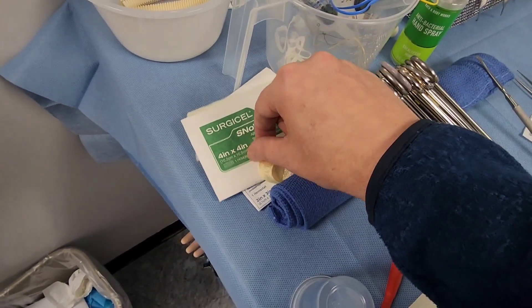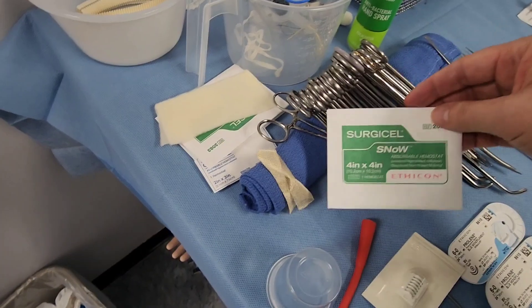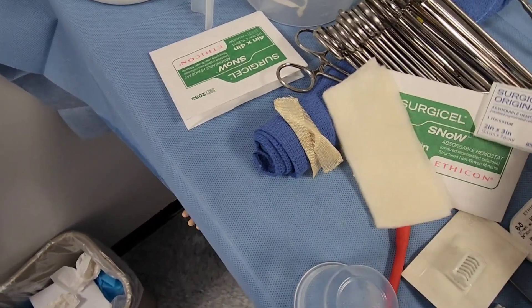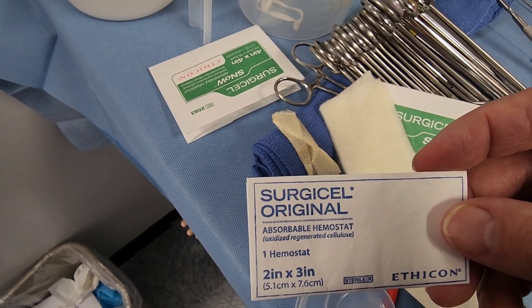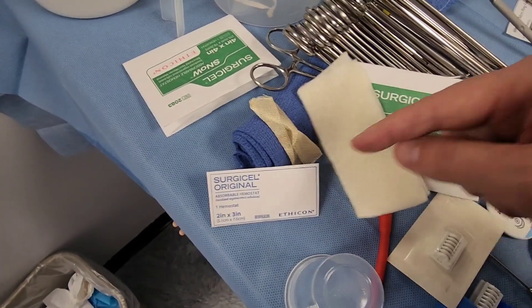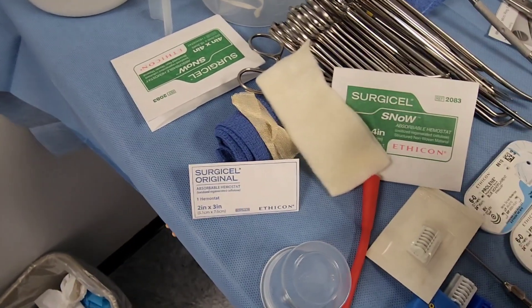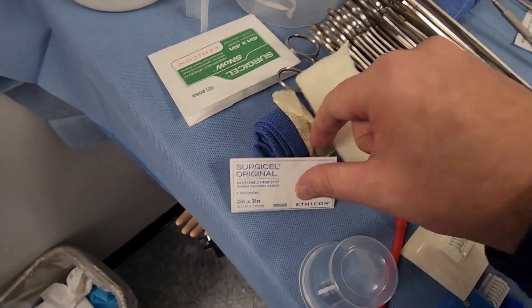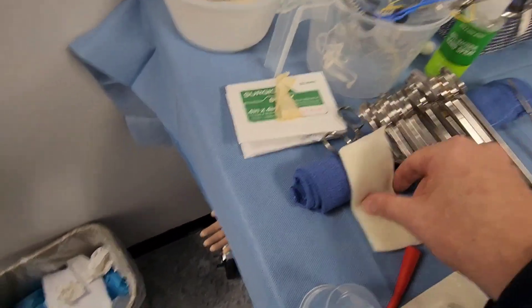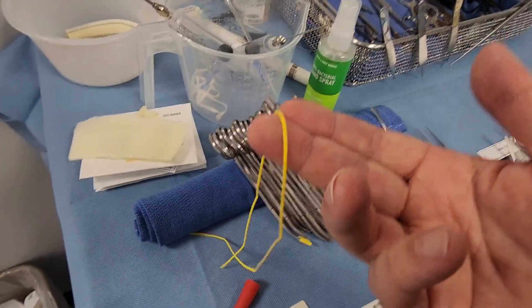Here we have hemostatic agents: Surgicel and Snow. These are absorbable hemostatic agents made of oxidized cellulose. The biggest difference between Snow and Surgicel is that Snow is a little more fine and can get into smaller crevices. Both are designed to stop bleeding. Hemostatic agents are really important in any kind of vascular case, because bleeding is the primary issue.